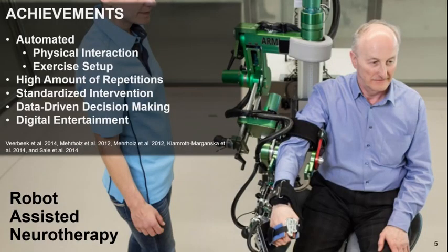Robots like the upper limb exoskeleton in the image were developed to automate physical interaction and exercise setups. They provide high amounts of repetitions, standardized interventions, data-driven decision making, and combined therapy with digital entertainment. These achievements could be demonstrated by various studies.